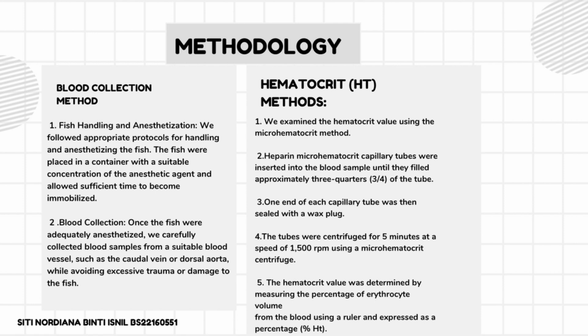Today I will present the method for hematocrit. The first is the blood collection method: fish handling and anesthetization. We followed appropriate protocols for handling and anesthetizing the fish. The fish were placed in a container with a suitable concentration of the anesthetic agent and allowed sufficient time to become immobilized.